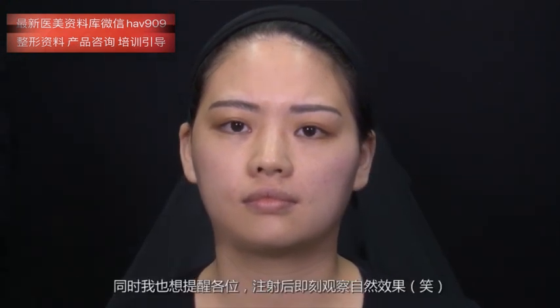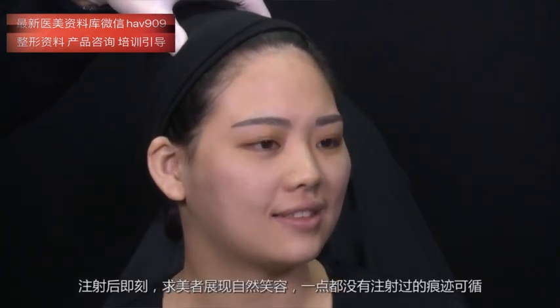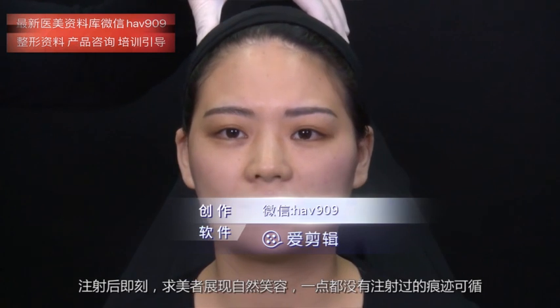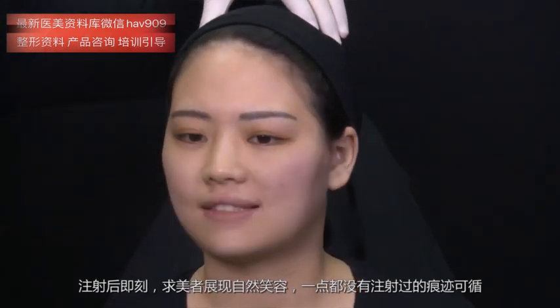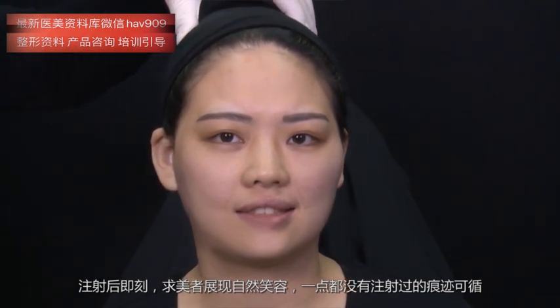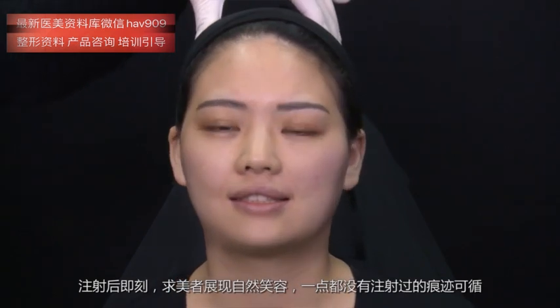What I would like to mention to you is this. Please observe the natural result immediately after. Smile. So immediately after, she presents natural smiles and not at all stigma or presence that she was injected.